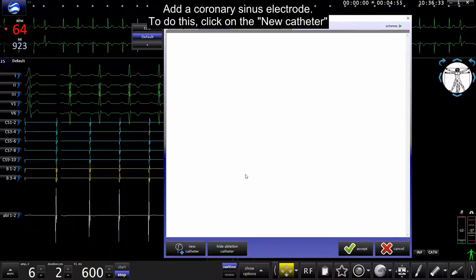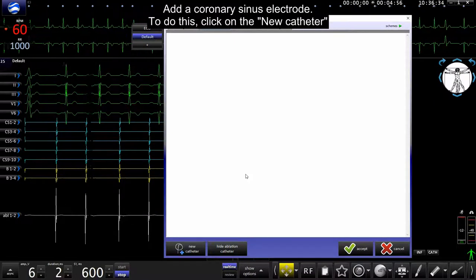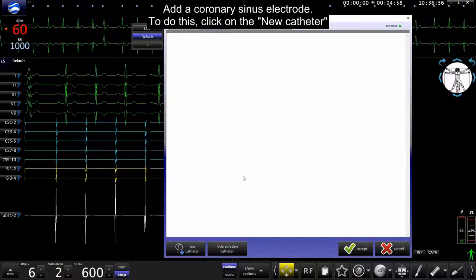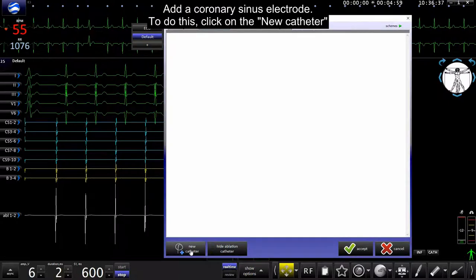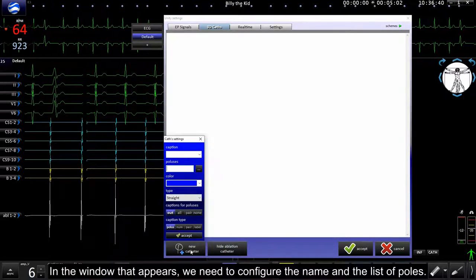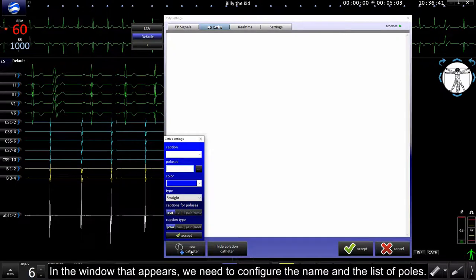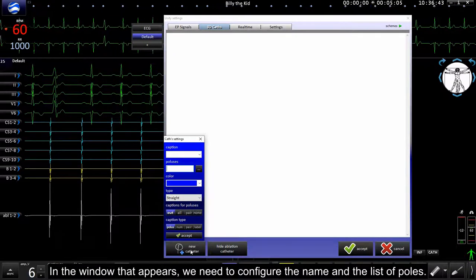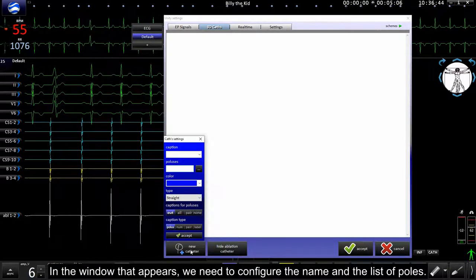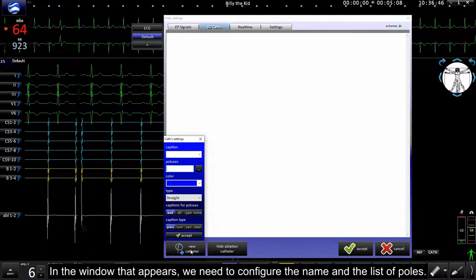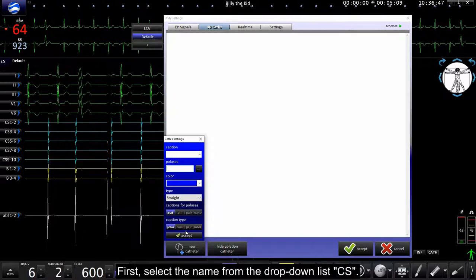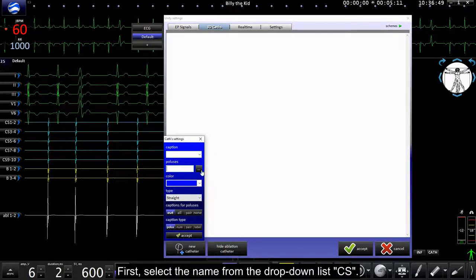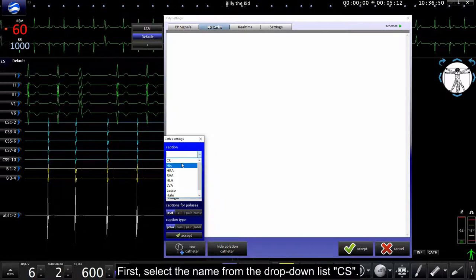Add a coronary sinus electrode. To do this, click on the new catheter. In the window that appears we need to configure the name and the list of poles. First select the name from drop-down list CS.